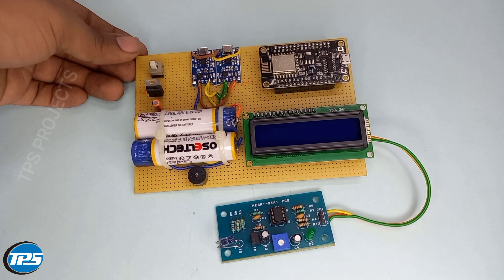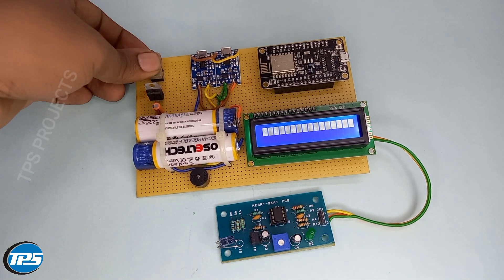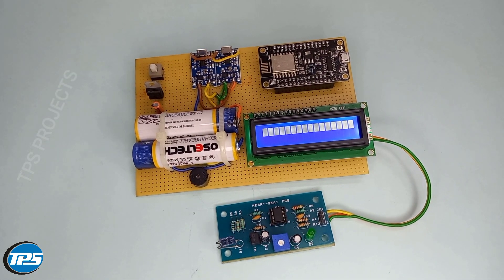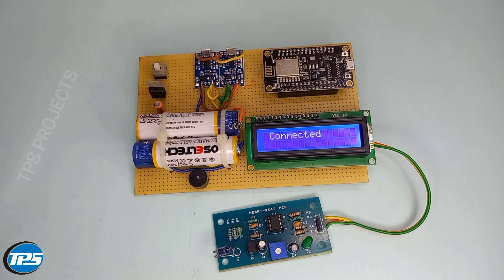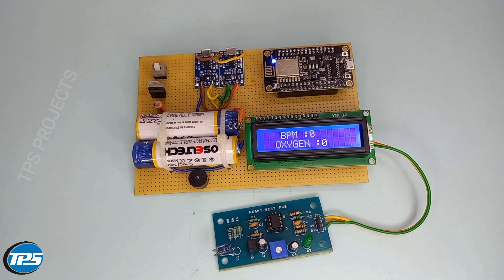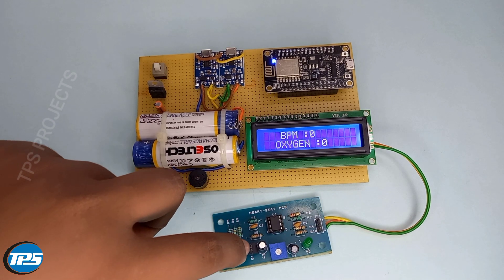Now we can see the working of the system. It is asking for a Wi-Fi hotspot, as it is integrated to the cloud database system. Through the internet, it sends the oxygen and heartbeat level to the Blynk app.